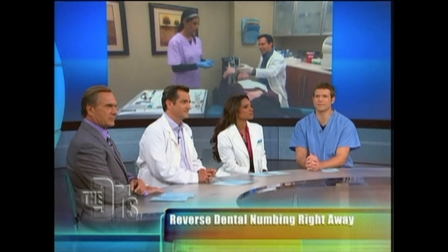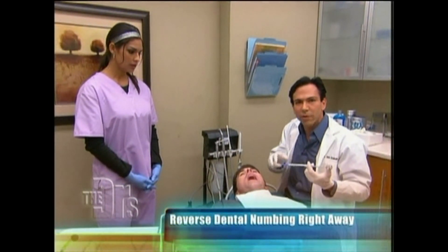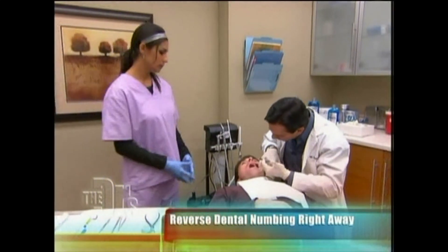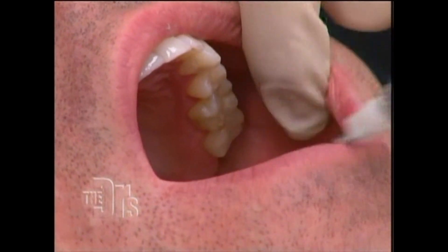Kevin, thumbs up — you still doing good? Yep. Okay, so this is the Oraverse. We'll go ahead and inject this just like we do the regular anesthesia in the same place, and this will make his anesthesia go away. And let's remind everyone: Kevin is numb right now, so he doesn't feel the reversal stick. All right, we're all done. Well, thank you, and Kevin, thanks for being a participant today.